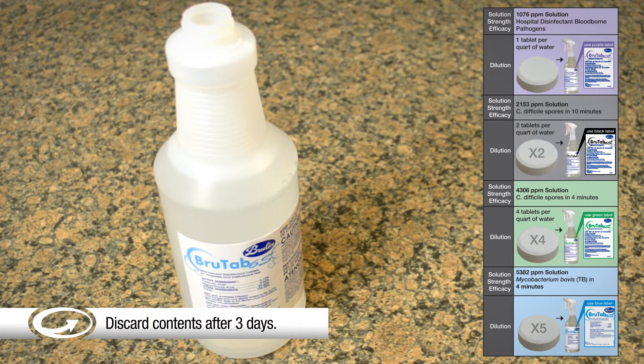And five tablets makes a 5382 ppm solution for killing Mycobacterium bovis, TB, in 4 minutes.